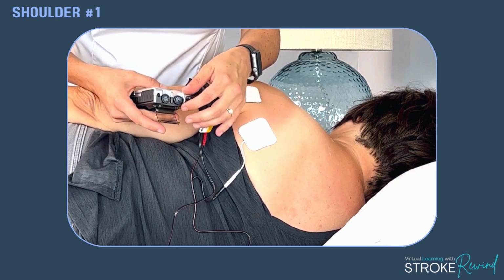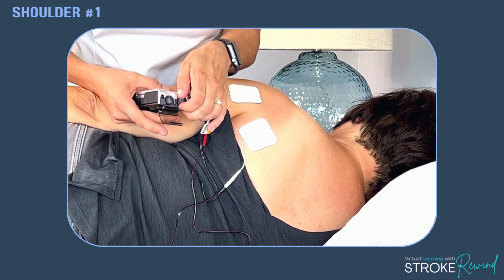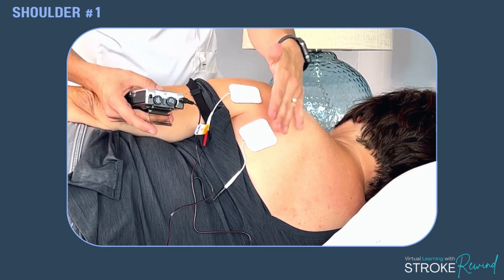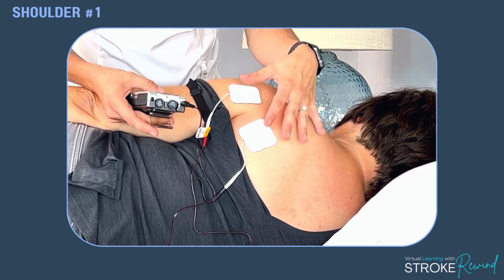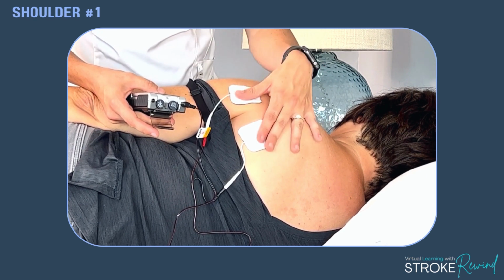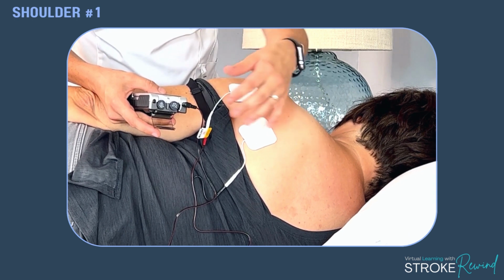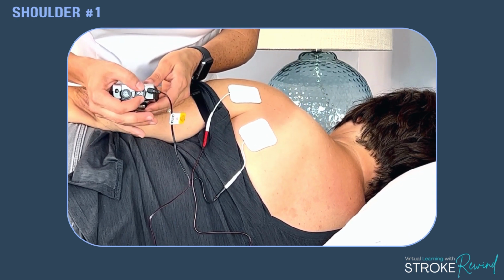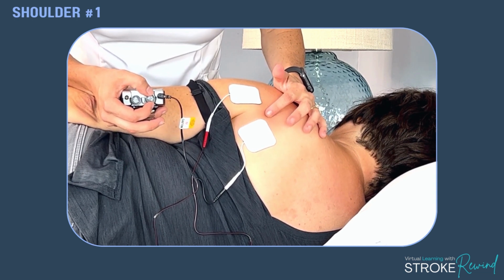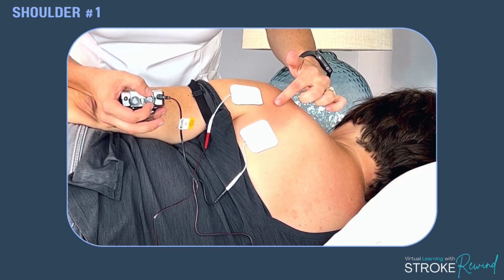So do you feel it yet, or not yet? Okay, so I'm going to keep moving up. How about now? Yes. Okay, you feel it. So now that she feels it, you're going to slowly start increasing it until you start to see it move, or until she says that feels good. So remember, even a feeling sensation of this electrical impulse is just as good as a movement one, but we want to see a movement if possible. Oh, so you can see I'm seeing some movement. Does that hurt? No. See, now you can really see that movement.